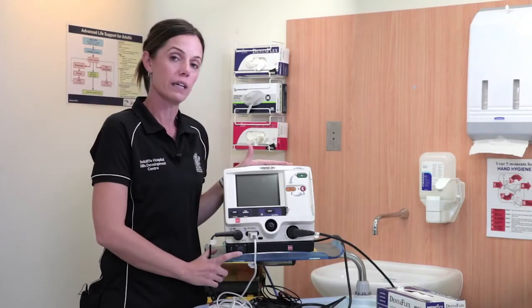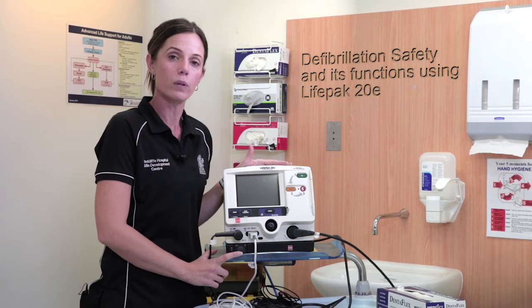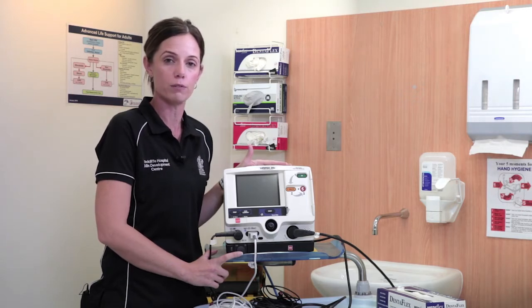The LifePak 20E is on all resuscitation trolleys throughout the hospital wards, with ED and ICU using the 12 and 15.